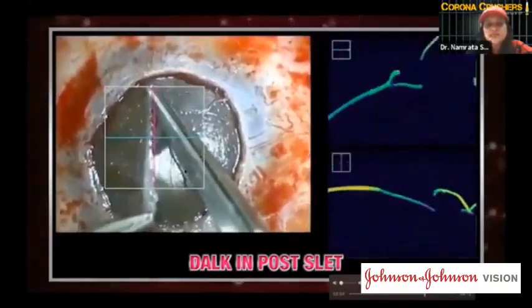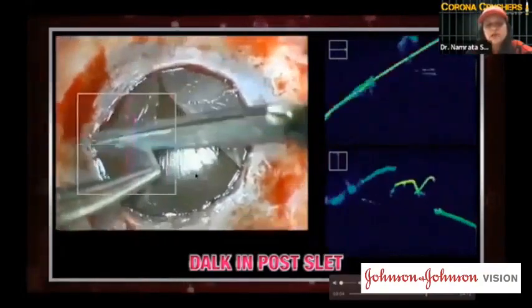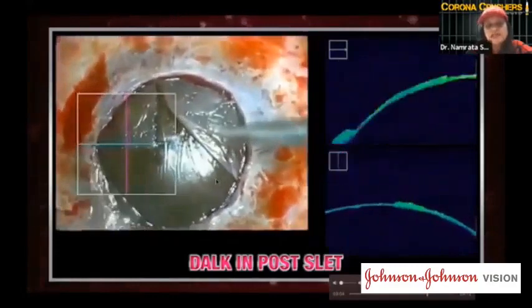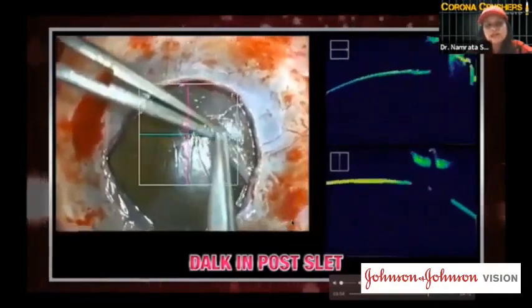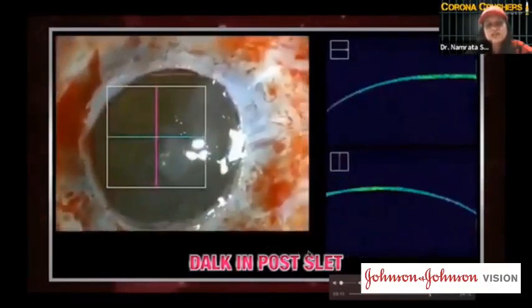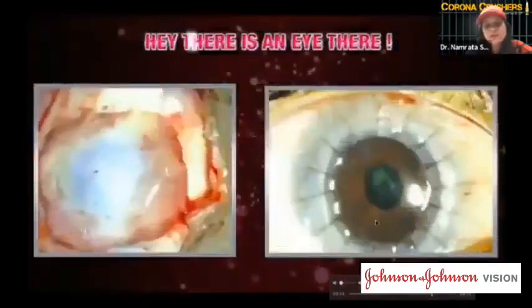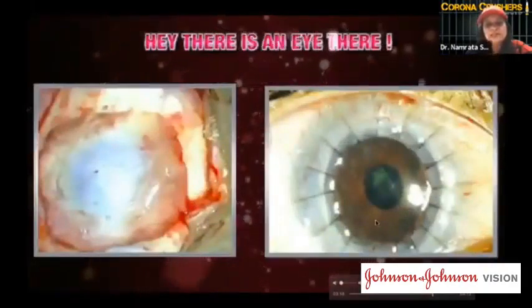And again, you will see that there is an iris there and there is a pupil there, and you're still extraocular. You have not entered the eye at all. It is an extraocular procedure. So where corneas are hazy underneath, there you may do a corneal transplant combined with it. And this is the post-op picture again with the visual acuity of 20 by 30.